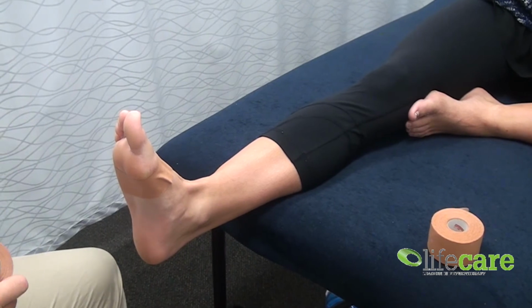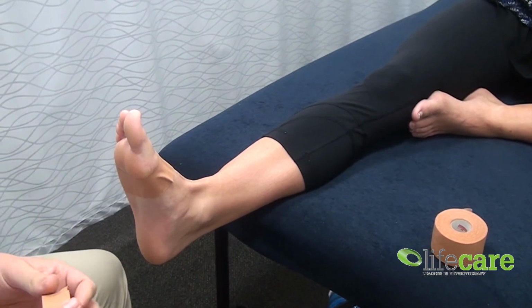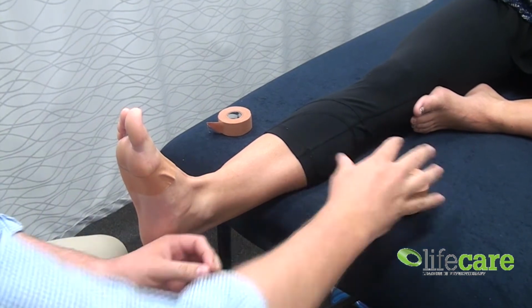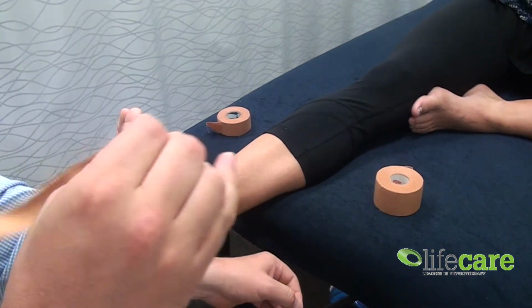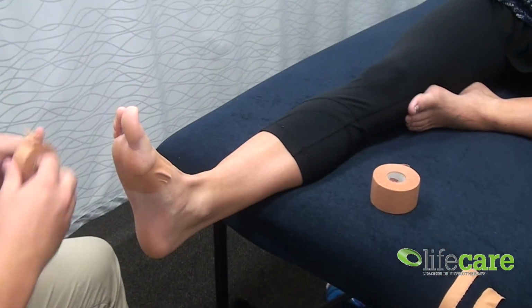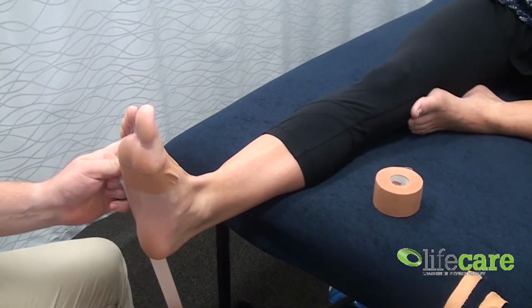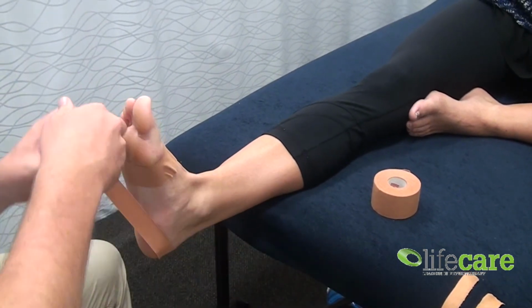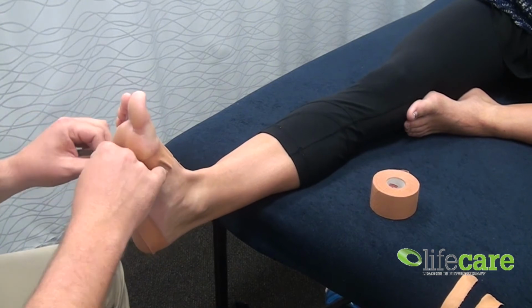From there, we're going to use the smaller tape. If you don't have that at your club, you can also get this wider tape and rip it in half, but that takes some practice and experience sometimes. Using the smaller tape, we're going to start on the side of the fifth, come around and come underneath and attach it back to where it started.